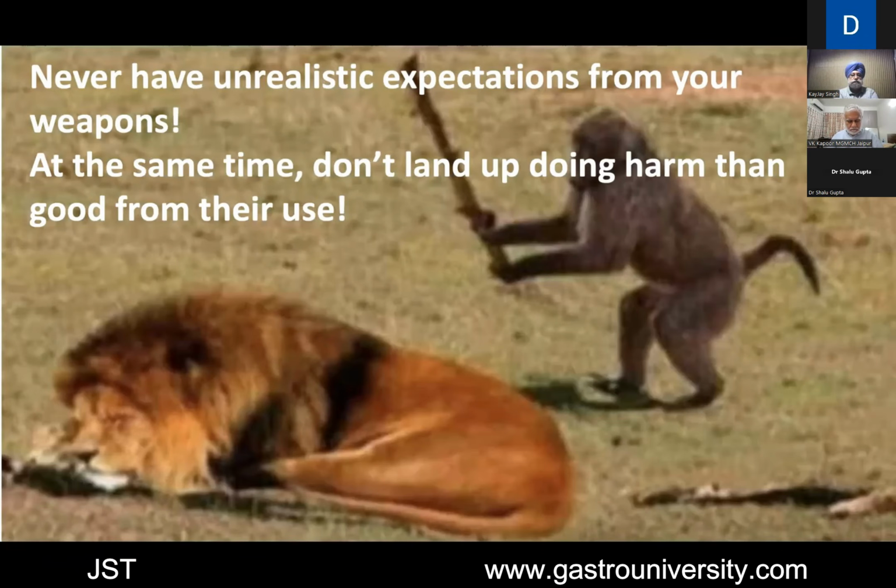Many times we saw there is a large liver. So we may go for another port, even on the left hypochondrium. If you need another port, no problem. You put another port, but do not do any injury to the structures.